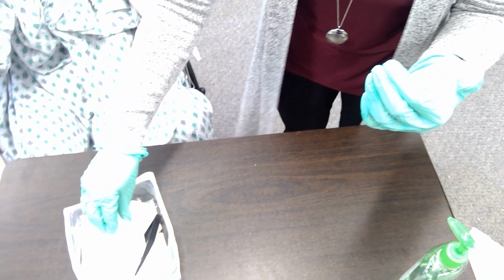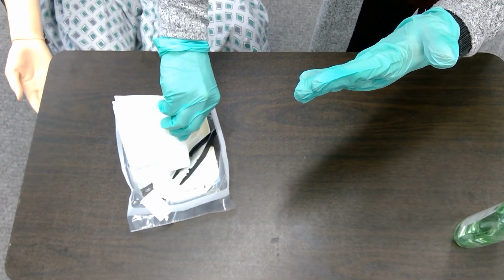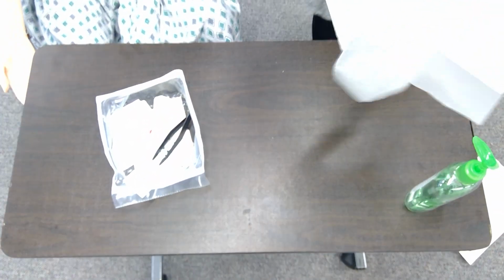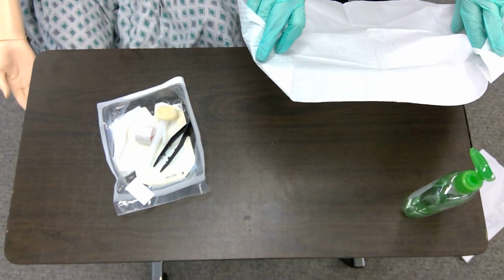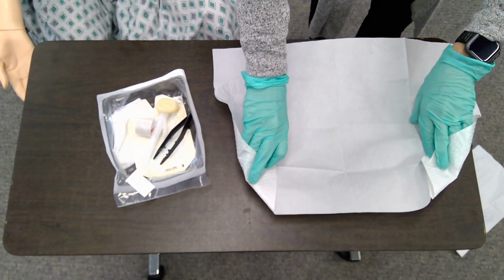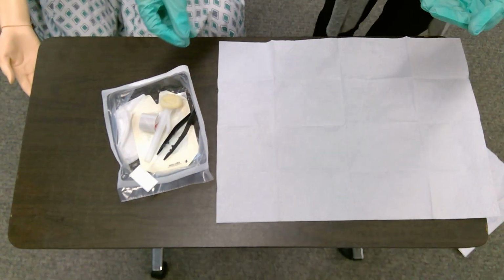That in the trash. Now I'm going to set up my sterile field. I'm sterile, so I can touch anything that is in this pack. Be careful when you're laying this down on the table. You don't want to contaminate your fingers. Make sure your fingers aren't underneath there.